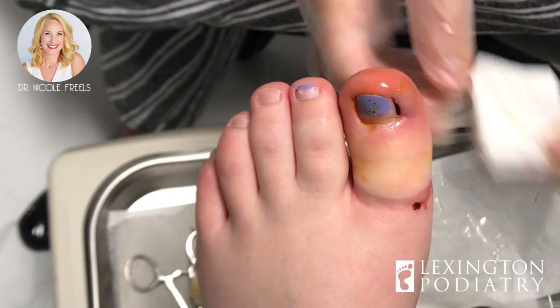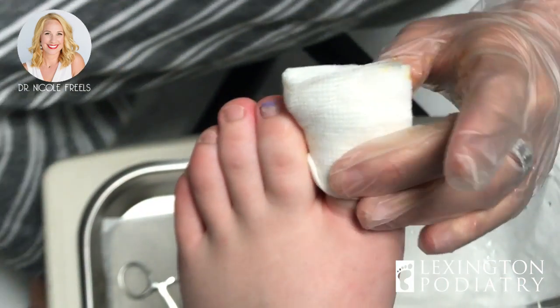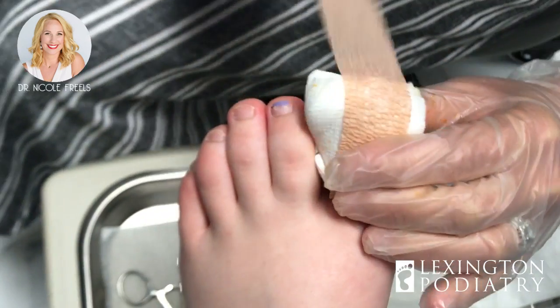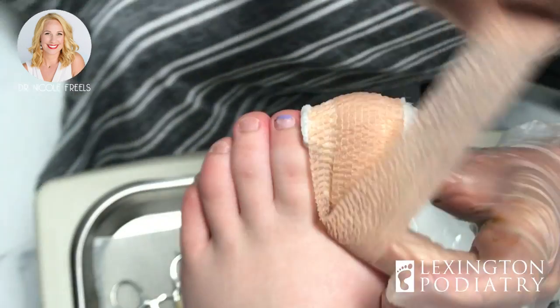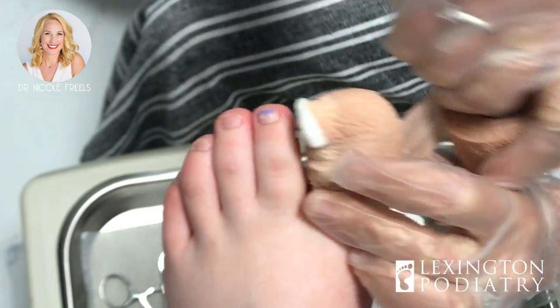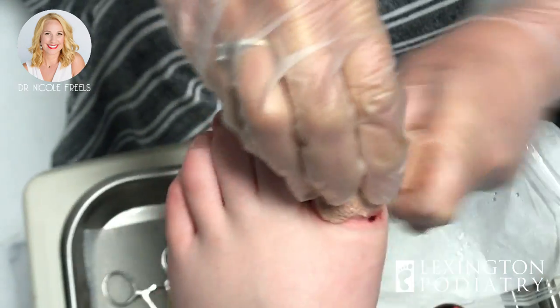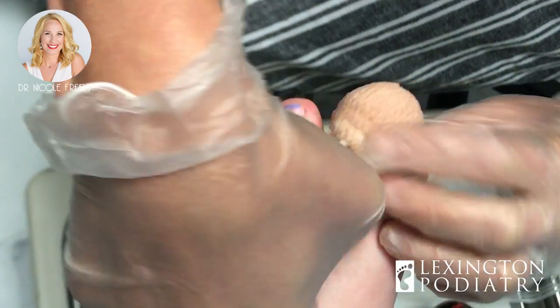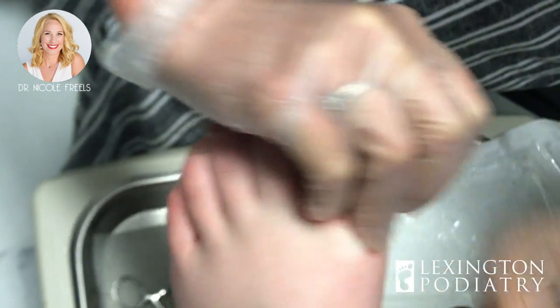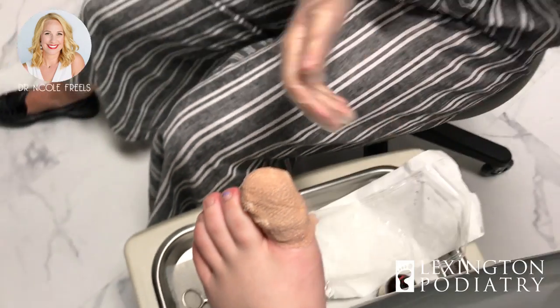Another ingrown toenail down! Caitlin, what's our time? 2:14. So start to finish about two minutes removing it, a couple extra seconds to bandage it up. Bada bing bada boom, we're done. You can go home, get this up in the air.